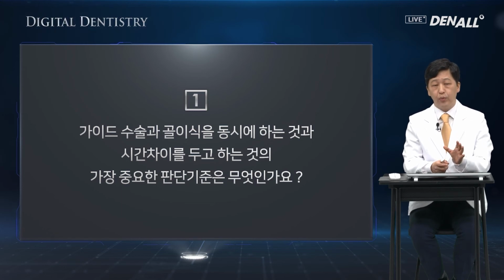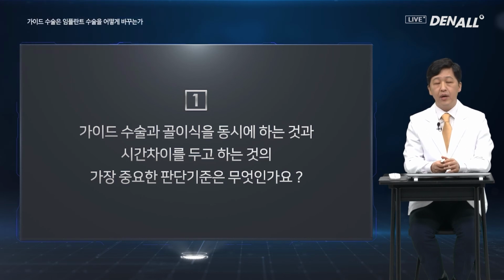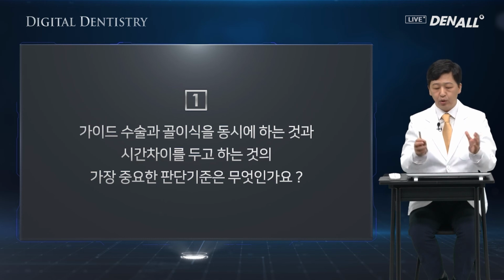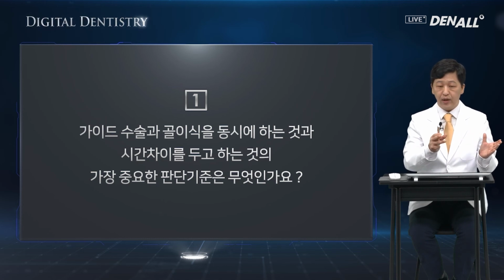using a guide, then in that case you need to do bone graft first and wait sufficiently. After that, you can use the guide for implant placement. That'll be most ideal. However, if the bone defect form allows for sufficient primary stability when the implant is placed, then I think you can do implant placement together with bone graft. That'll be a good option as well.